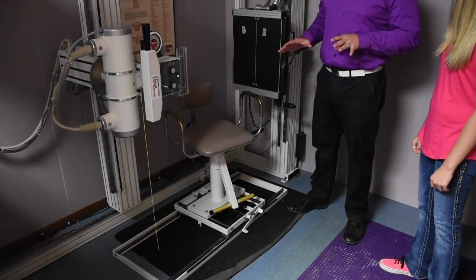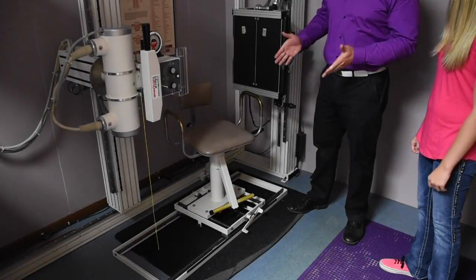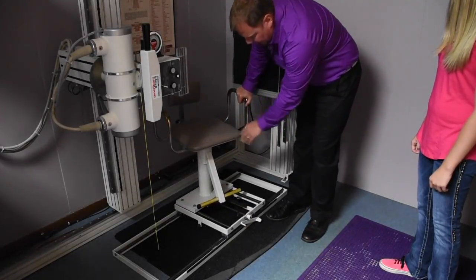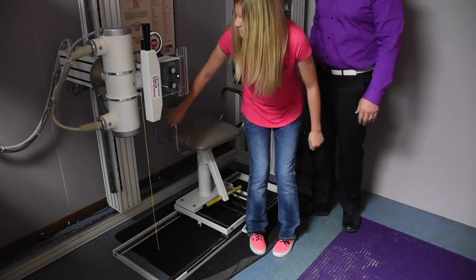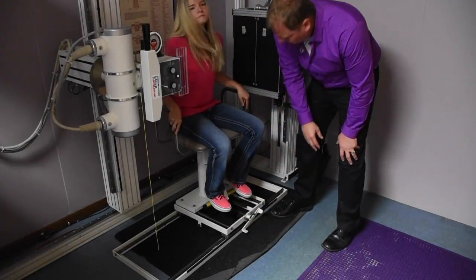So depending on the mobility and gait, carriage and gait of the patient, we'll determine how we get them on the chair. So the safest way is to unlock the chair, have it all the way in the back position, and that way the chair cannot move. So let's have you have a seat on the chair, and then instruct the patient to put their feet on the dowel.